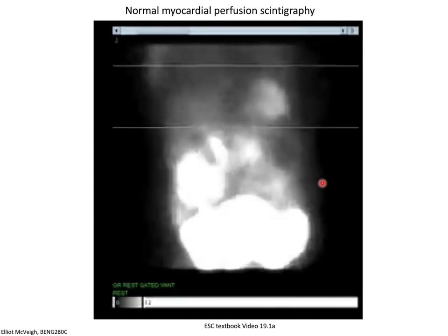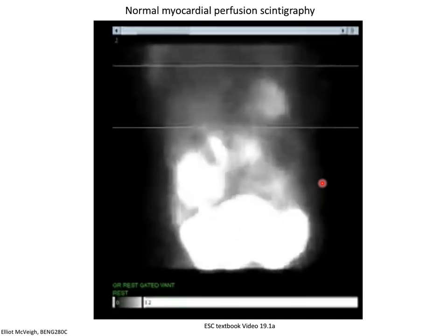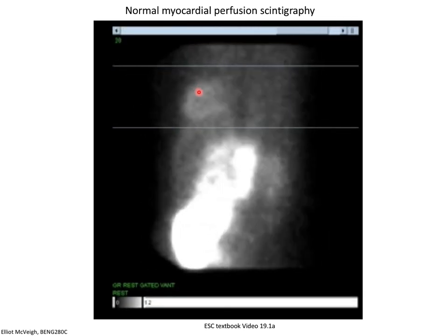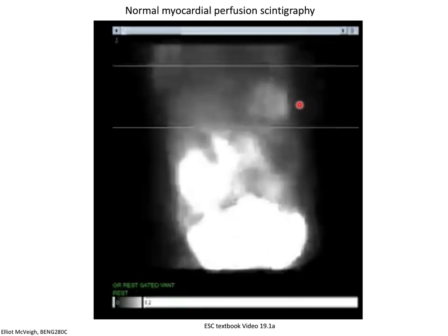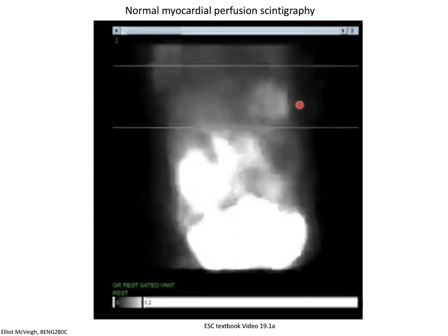So this is the raw data from which those images were obtained. And you can see kind of the fundamental signal to noise we're dealing with here. You see how there's hash on top of the signal, and that's basically just photon counting uncertainty. You just don't have that many photons to make this picture with.